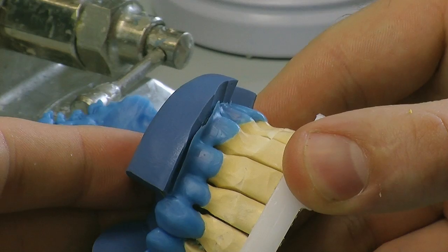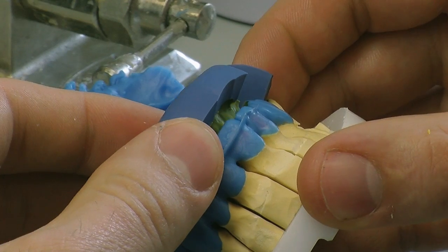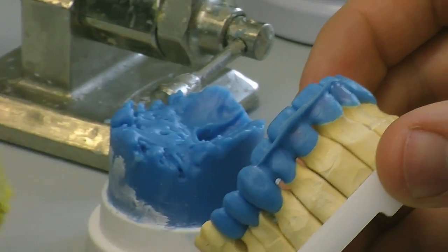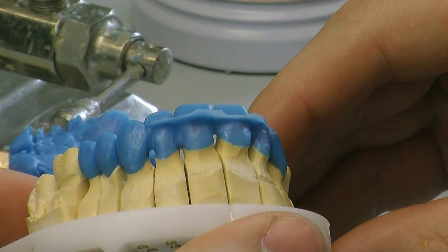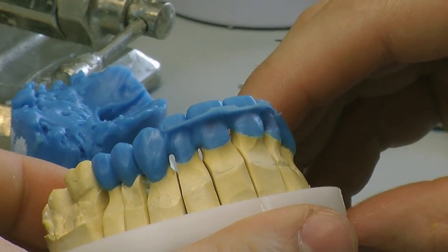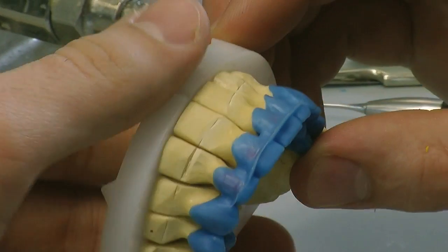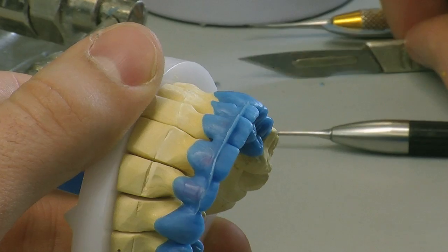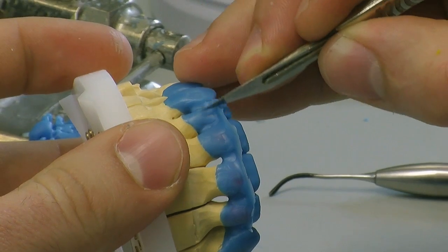The putty is gently teased away from the wax so it doesn't damage it in any way. And there we are. We've got a perfect incisal edge position, full contour, using a very accurate putty placed on it, has a palatal stop, so it has a 3-point contact on the arch. Now we're just going to take the flash off.